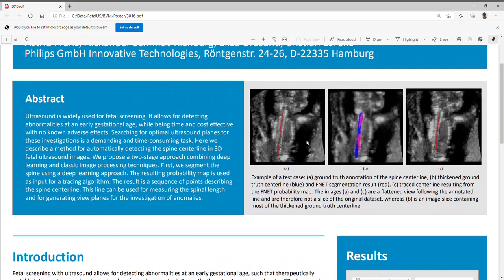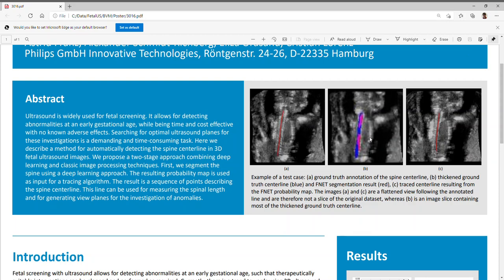An example of this is shown in Figure B. In Figure A, you see an example dataset with an annotated spine centerline. And in Figure B, this blue region here is the dilated centerline, which is a label mask which we used for the deep learning approach.